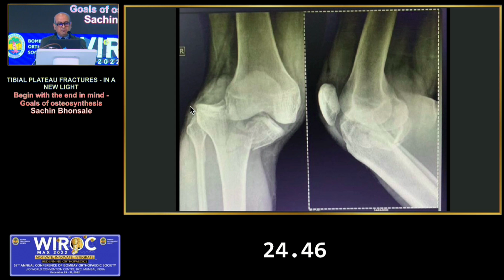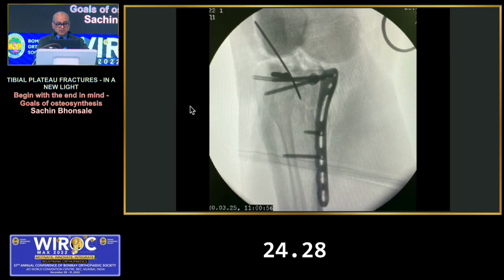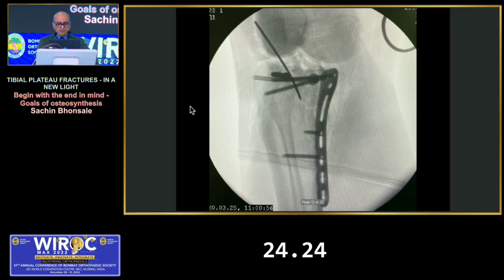That's one of the examples of a medial tibial plateau fracture, not exactly a Schatzker 4 fracture because there is some extension on the lateral side. Really nasty. It was almost a dislocated knee, and that is how I managed it. There was one small lateral fragment fixed with a K-wire, but a posteromedial plate did the job and restored the congruity of the fracture quite well.